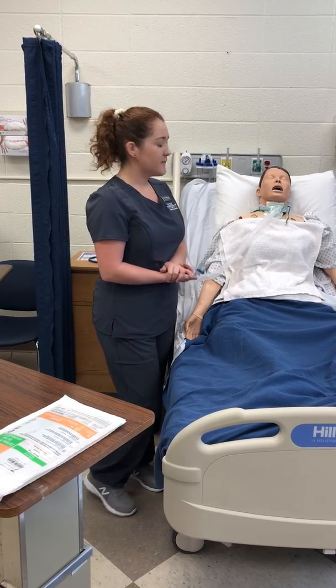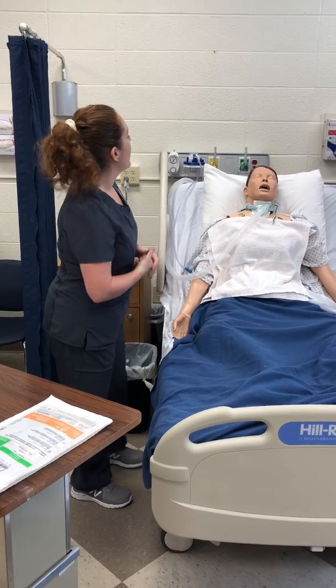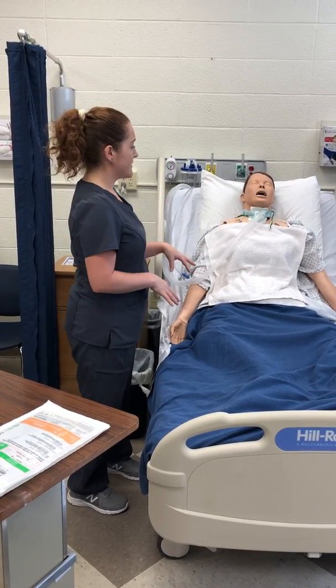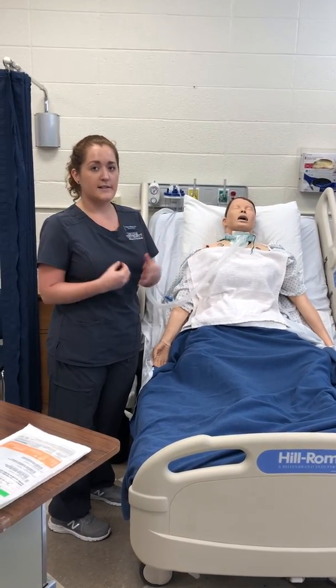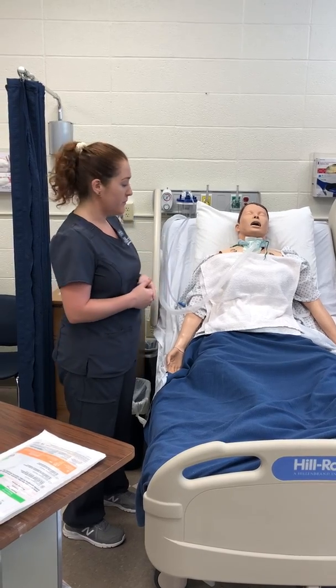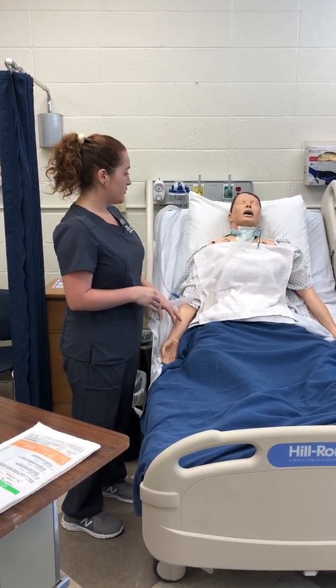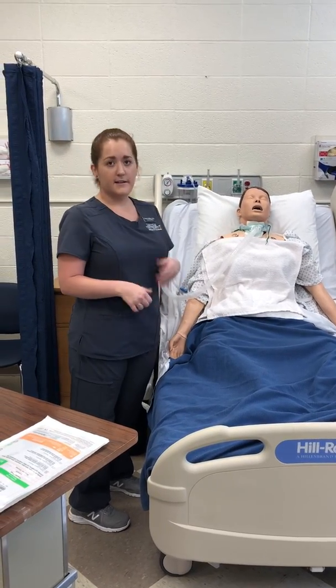I have introduced myself to the patient and verified his identity with two identifiers. I have assessed his respiratory status, pulse, and oxygenation. I currently have him hyperoxygenating before the procedure so that his oxygen saturation does not drop too low. I have also established a form of communication with the patient, John — he will raise his thumb if he is in any distress.